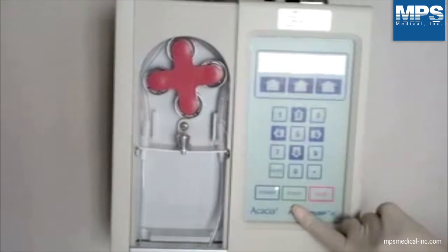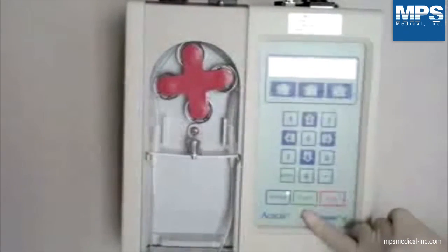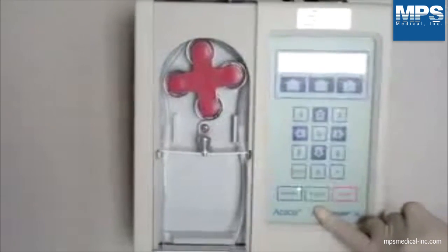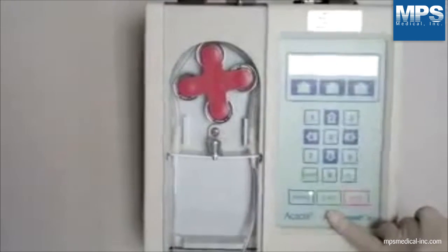At this point, you may prime the line. Press the start function key. Note: this is not a set priming volume. When you verify the tubing is primed, press the stop function key, followed by the abort function key.